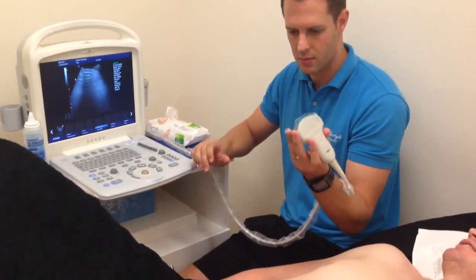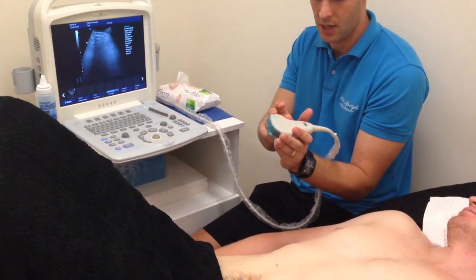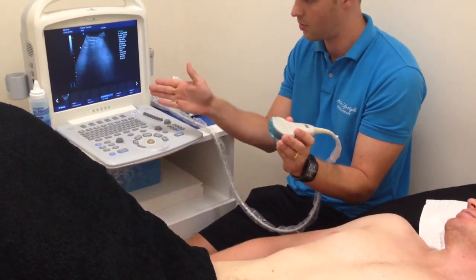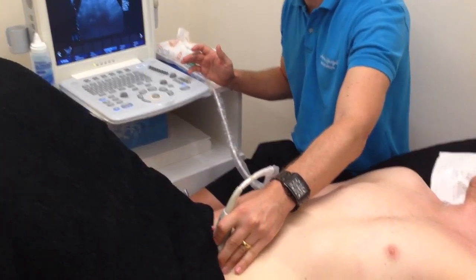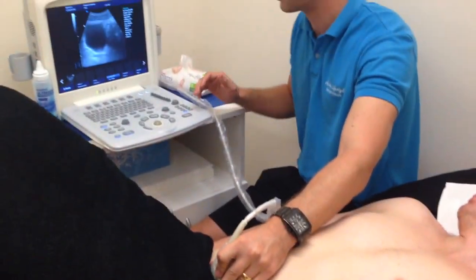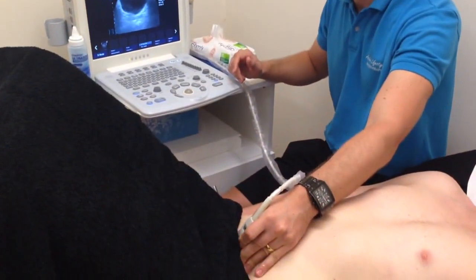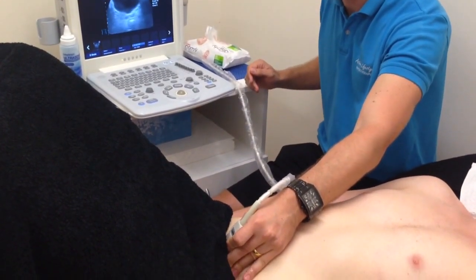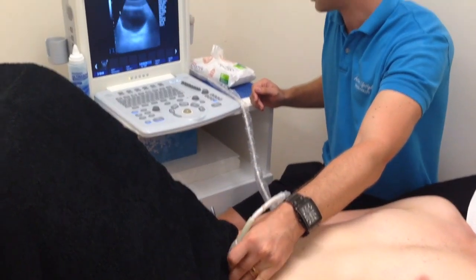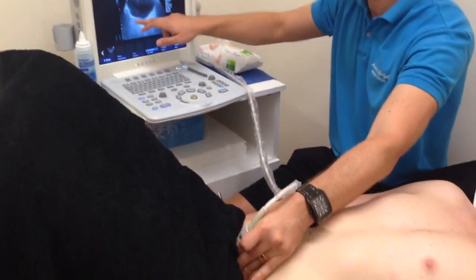Let's have a look at Ben's pelvic floor muscles. As with convention, we're going to have the left side of the screen on the patient's right. To get a good look at the pelvic floor muscles, we're going to be looking through the bladder. The probe is positioned just above the pubic bones in the midline, and first we're going to take a transverse image, which will give us a look at the base of the bladder.